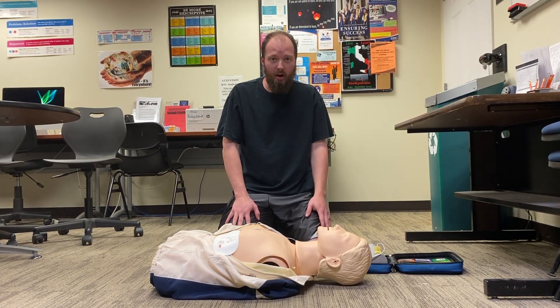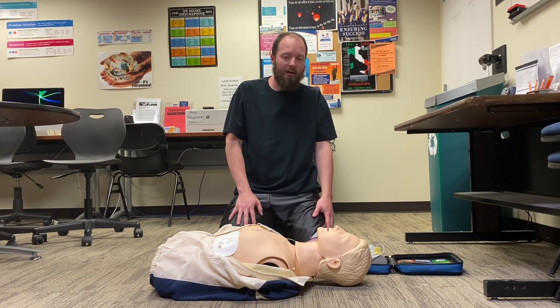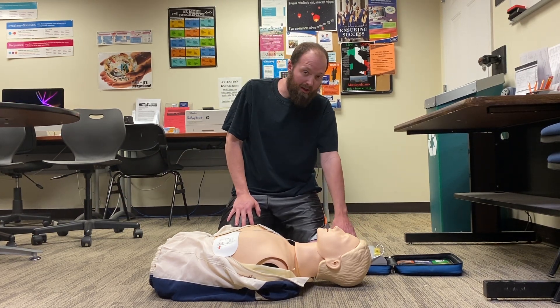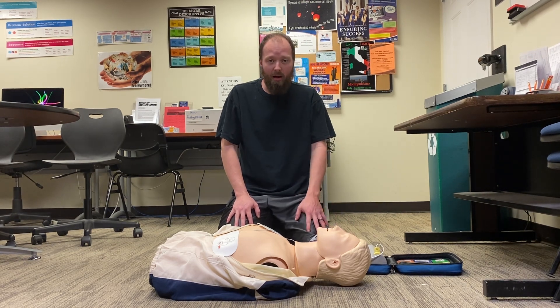If a shock is needed, it will let you know to do that. You will again want to make sure that you clear the patient, make sure no one's touching them, and then when directed by the AED, you simply push the button, or it may give it automatically.